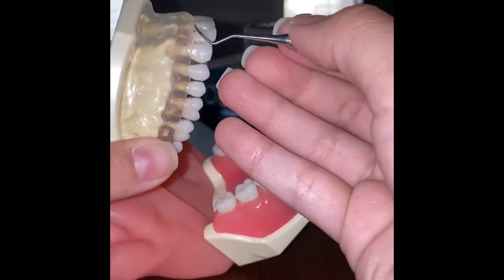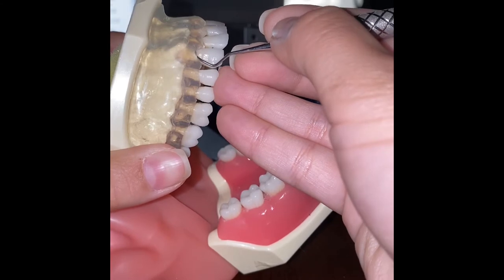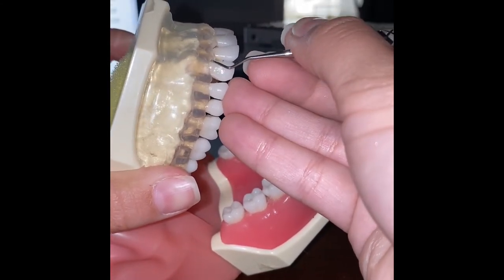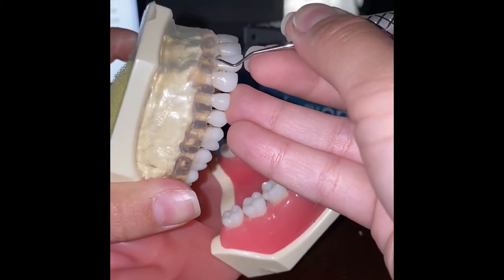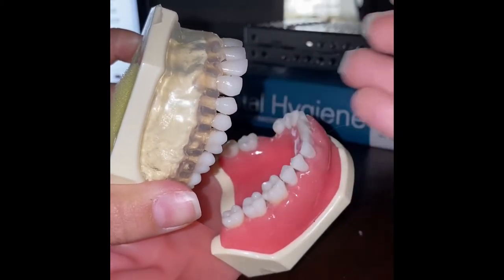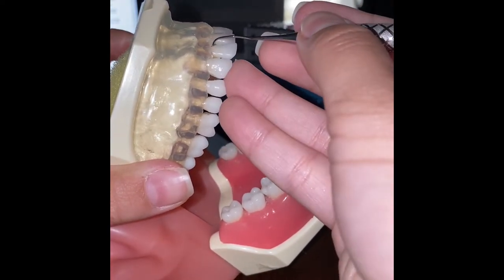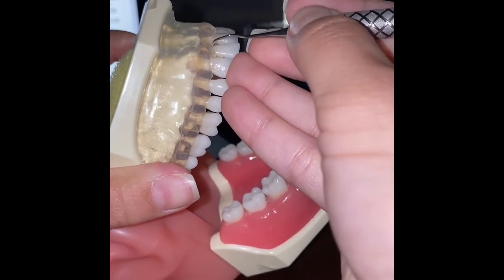We'll be working on anterior away surfaces on teeth 6 and 7, beginning at midline. Now working on toward surfaces, we begin midline, insert open, and activate.